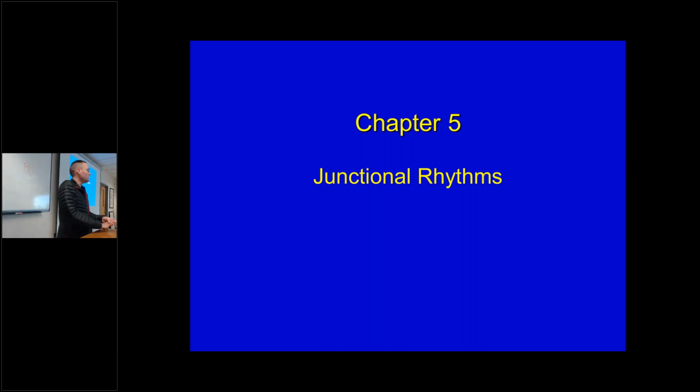The difference between AVRT and AVNRT, when it's tachycardic, you can't tell the difference. So don't worry about that. I'm not going to give you a strip of a tachycardic and ask you to tell me if that's AVNRT or AVRT. You can't tell the difference until you slow that down. For the most part, for what you guys are learning, AVRT is going to be with WPW.